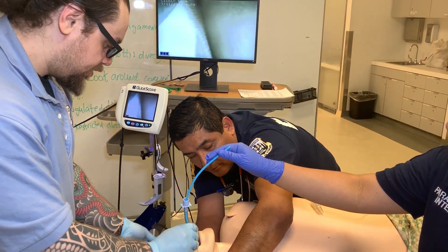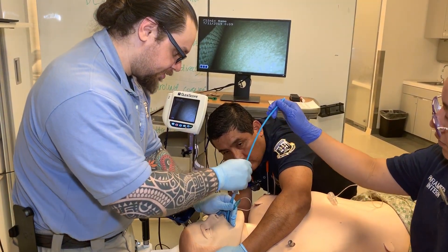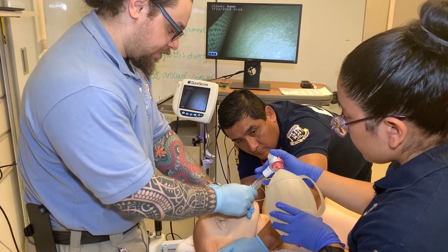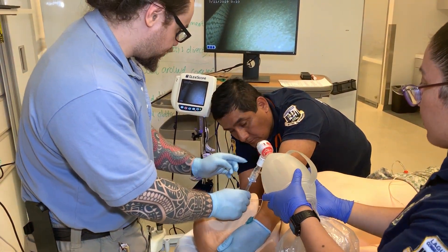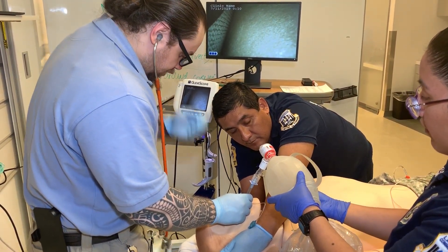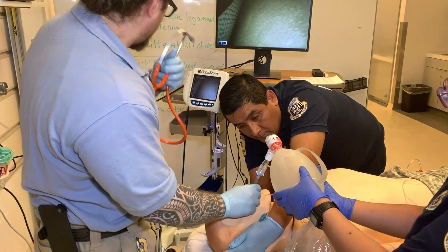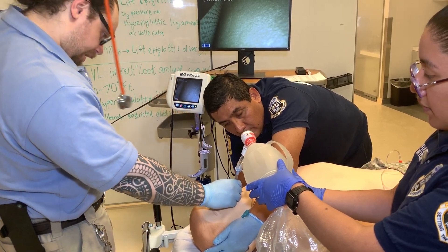Now I can take out my blade, inflate my cuff, and my partner removes the bougie. I immediately connect capnography, which is connected to a monitor. Throughout this whole procedure my partner is maintaining the MILS. I'll borrow a stethoscope to auscultate lung sounds. I want to hear negative epigastric sounds — good. Positive breath sounds bilaterally — good. I've confirmed positive breath sounds, negative epigastric sounds, and my end-tidal CO2 was 35 — I know I'm in the correct location.